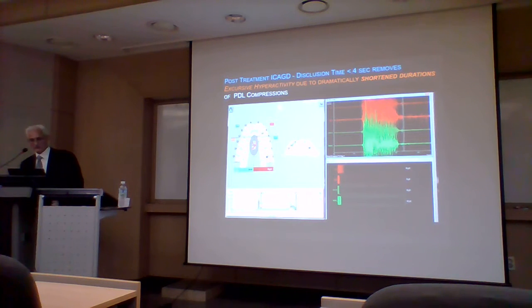So you can see that as she moves, quickly she reaches her anterior guides, and then the muscle activity drops out very fast. And that's how we control muscle overload, and we control symptoms that way. 안테리어 가이던스를 전방에서 가이드가 만들어주니까 구치부 쪽에 머슬 액티비티가 안테리어 가이던스 바꿔주고 난 다음에 확 없어진 걸 보여주니까 그로 인해 TMD는 없어질 수 있다고 얘기를 하신 거죠.